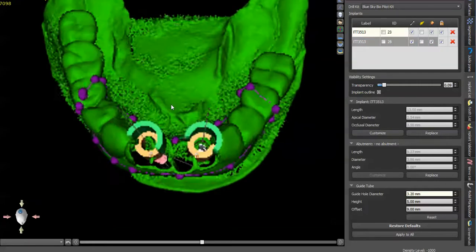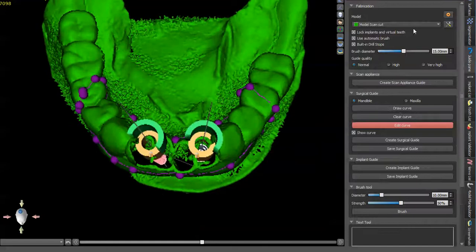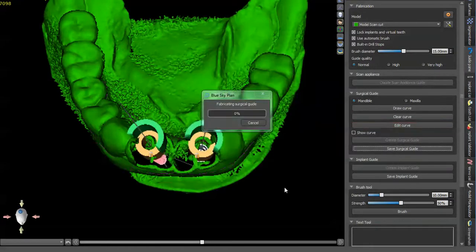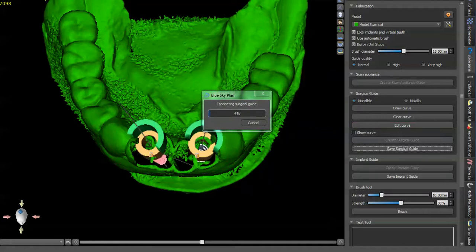Otherwise, those metal sleeves will not fit. Back in the guide panel and just press create surgical guide. This takes a little bit of time. So that's done.